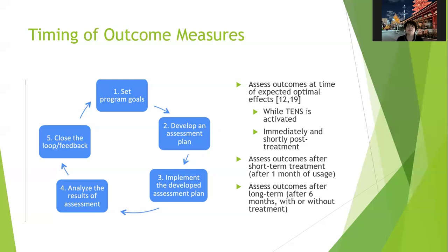So really, ideally, you want to assess either while you have the TENS on or immediately afterwards. And then short-term, and if you have the ability to do it long-term, just to see if it's having some long-term effects.